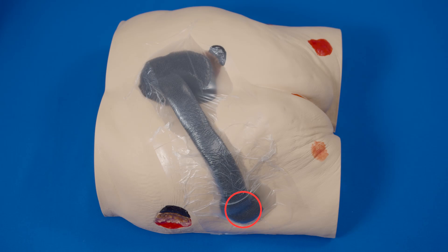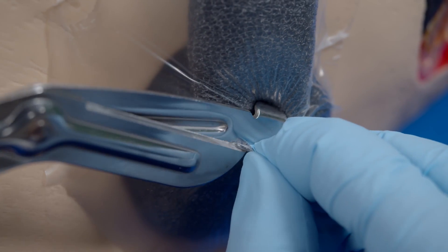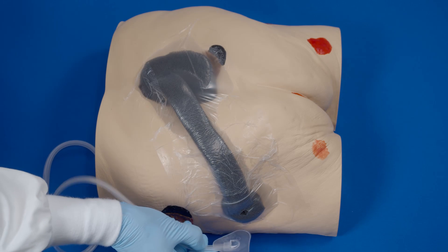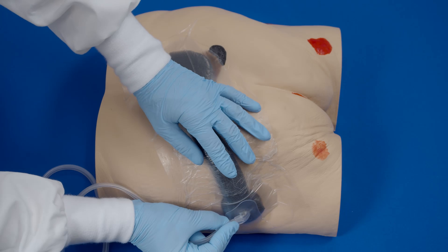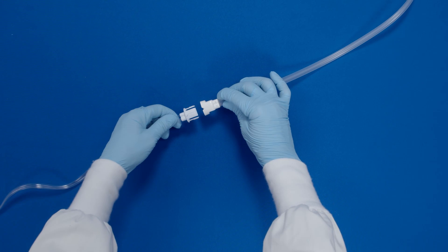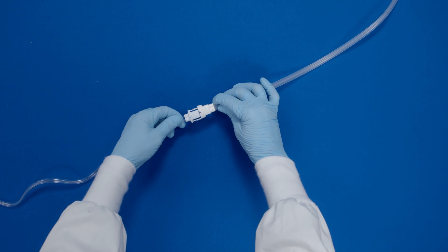Place the fit pad on the foam at an appropriate location. Pinch the film, lifting slightly, and cut a small hole approximately 1 centimeter in diameter. Peel off the backing of the fit pad to expose the adhesive. Place the fit pad centered over the previously cut hole and press firmly for adherence. Attach the dressing tubing to the pump tubing by pushing the quick connector together until you hear a secure click.